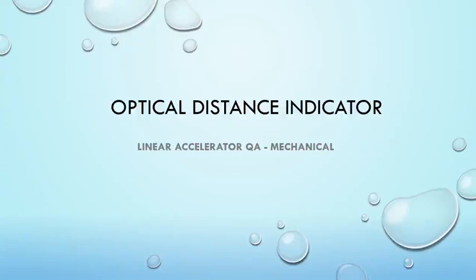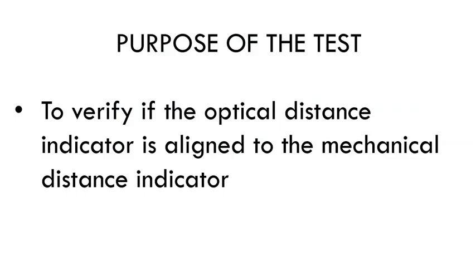This is the test to check the optical distance indicator — part of the mechanical QA for the linear accelerator. The purpose of the test is to verify if the optical distance indicator is aligned to the mechanical distance indicator.